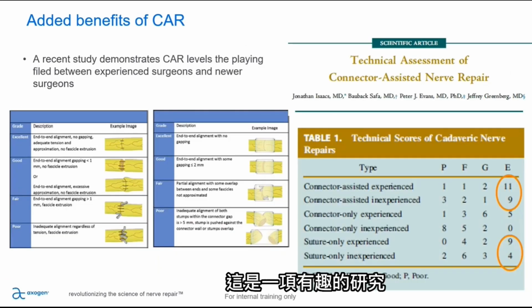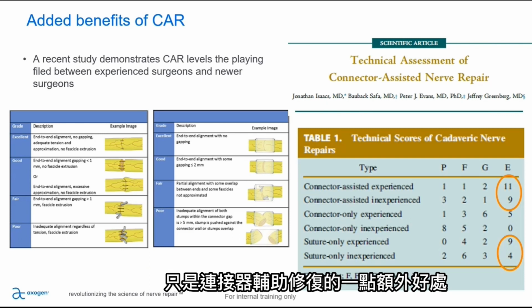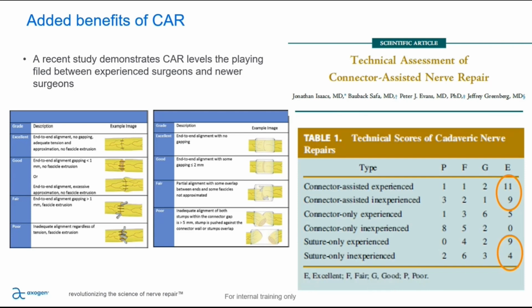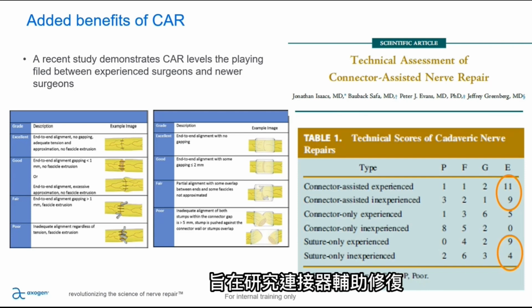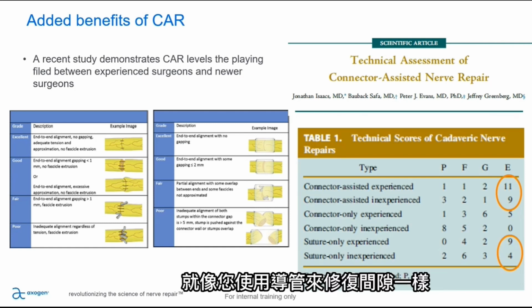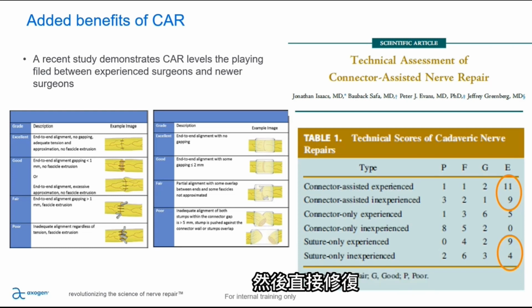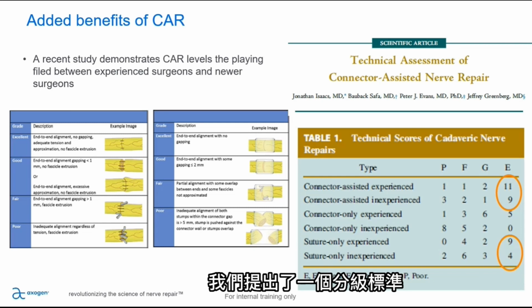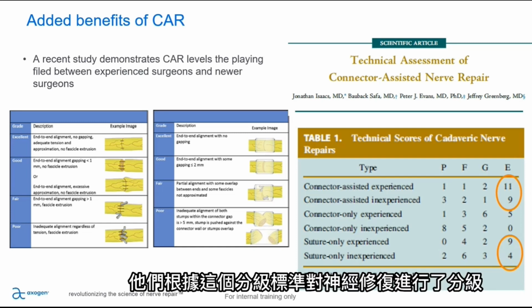Now, this is an interesting study, just a little added benefit of connector-assisted repair. This was a cadaver study that we did that looked at connector-assisted repair, conduit only, which was essentially leaving a large gap, like if you were using a conduit to repair a gap, and then direct repair. And we had experienced surgeons and we had inexperienced surgeons doing all of these techniques. And we came up with a grading scale. And then we had some blinded assessors who went around and graded the nerve repairs based on this grading scale.